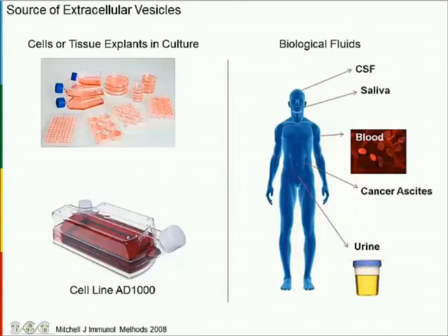I don't have a great solution for you here, but certainly in my lab, we've had a lot of success using these miniature bioreactor type of flasks, these cell line culture systems here, where the cell density can be much higher. This gives you a huge advantage of simply handling less volume.